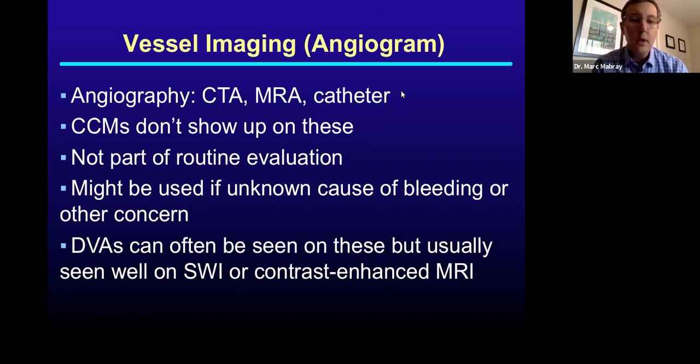I should note that the developmental venous anomalies that we were discussing can be seen on these studies, although those are pretty well demonstrated by other studies such as the regular MRI sequences that Dr. Hart was mentioning.